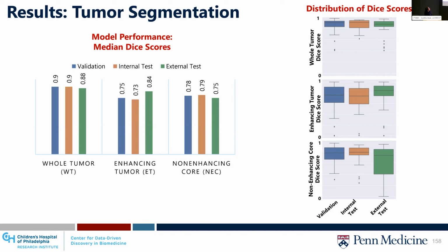As you can see from these plots, our whole tumor segmentation consistently works well across different patients. The enhancing tumor and non-enhancing core are sometimes difficult in some patients if the quality of MRI is not high, or there are weakly enhancing tumor regions that may be segmented as the other group, which is usually very difficult for expert neuroradiologists as well to segment.